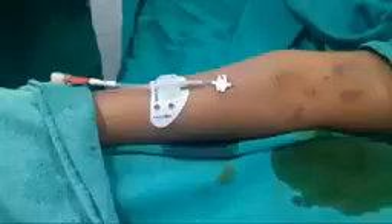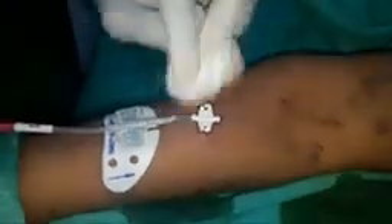I am securing it with suture. The butterfly has been secured at the puncture site with a 3-0 prolene suture.